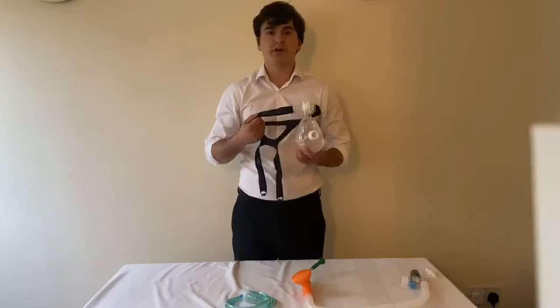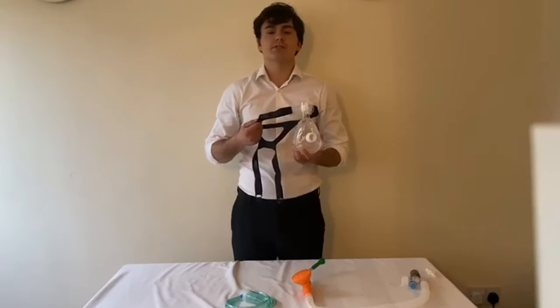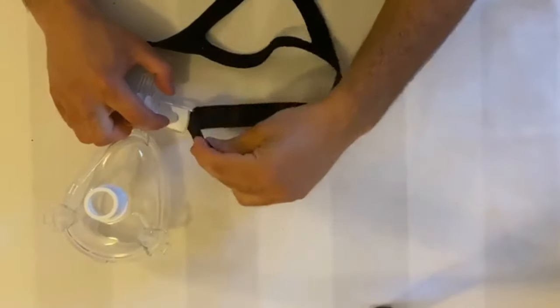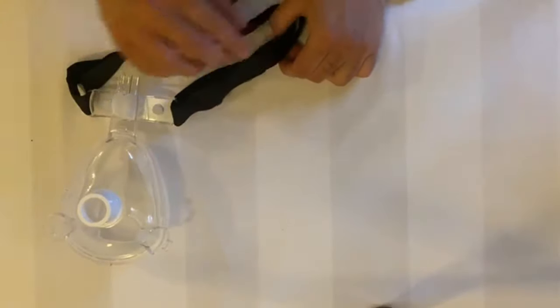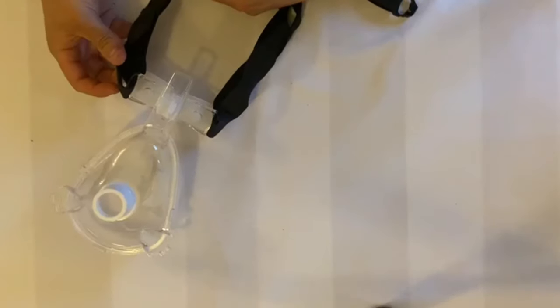The headgear contains a second velcro strap at each point of attachment to the mask. These can be used to reduce the size of the headgear for smaller heads without causing any excess strapping. Simply pull the second velcro tab through the loop and stick down. The remaining strapping can then be stuck to the headgear. Ensure any adjustments made on one side are mirrored on the other to maintain comfort.